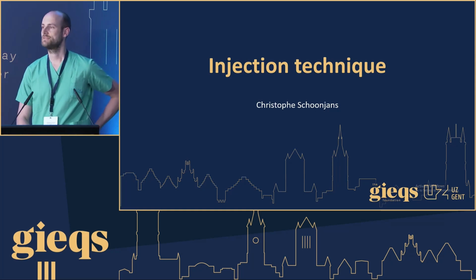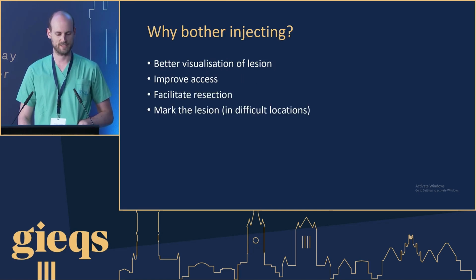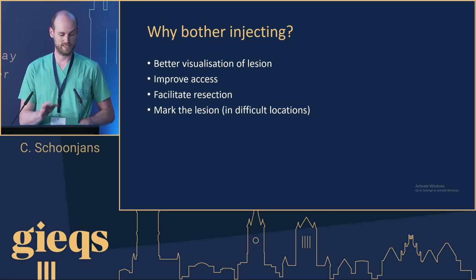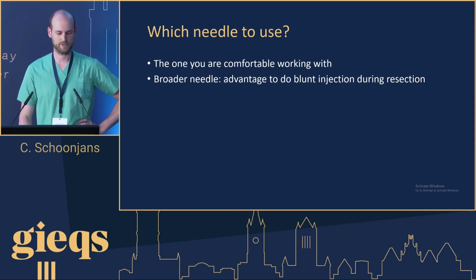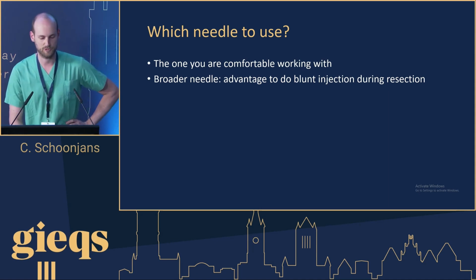Okay, thank you. Indeed, a beautiful demonstration of the injection technique. I'm going to go through a stepwise approach of the technique and the concept of dynamic injection. So why bother injecting? You want to better visualize a lesion, improve your access to facilitate resection, or maybe if it's a difficult lesion, mark the lesion with injection to come back to it later if you're in a different position. Which needle you use for injection doesn't really matter that much, the one you're comfortable working with.